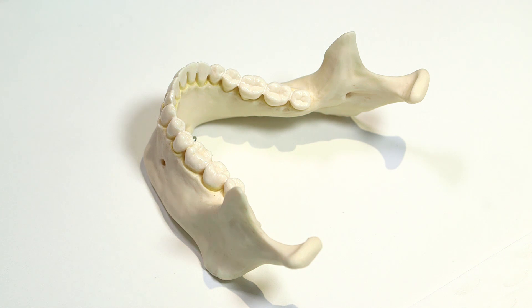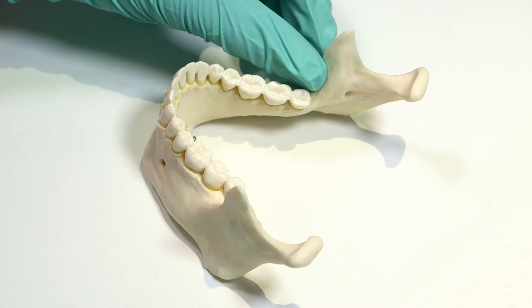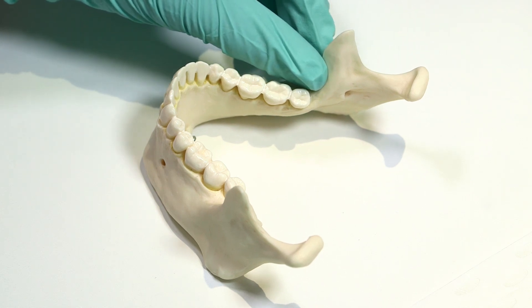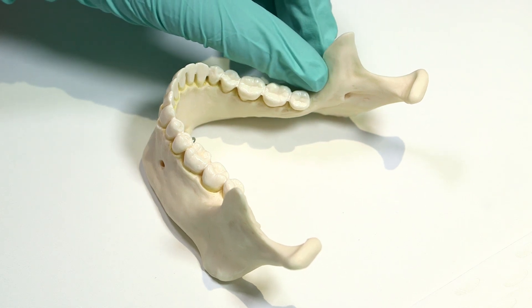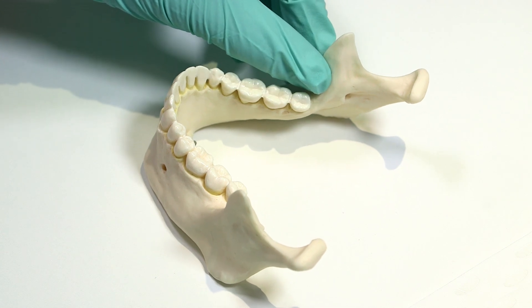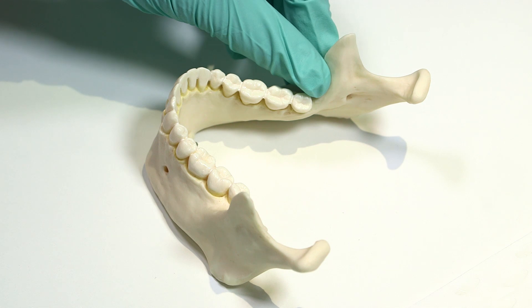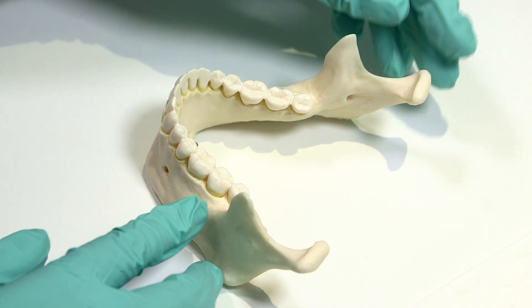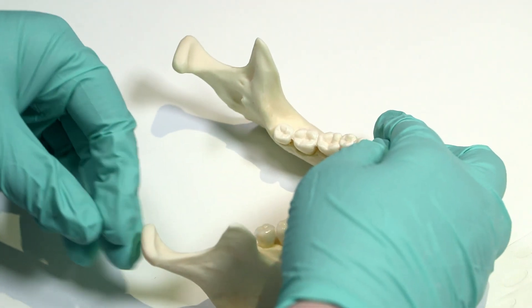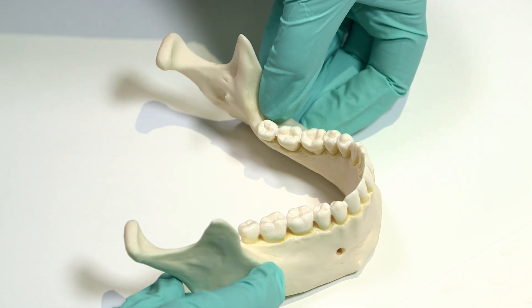The first part of the technique is palpating the coronoid notch and then moving our finger or thumb medially to palpate the internal oblique ridge. This is demonstrated on the right-hand side and also on the left-hand side.